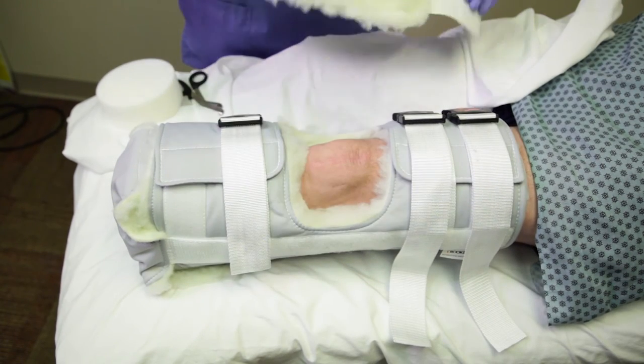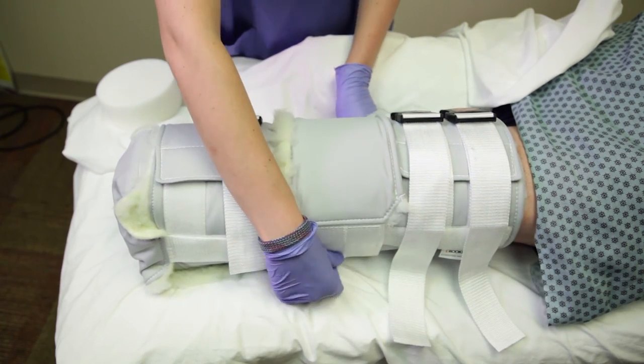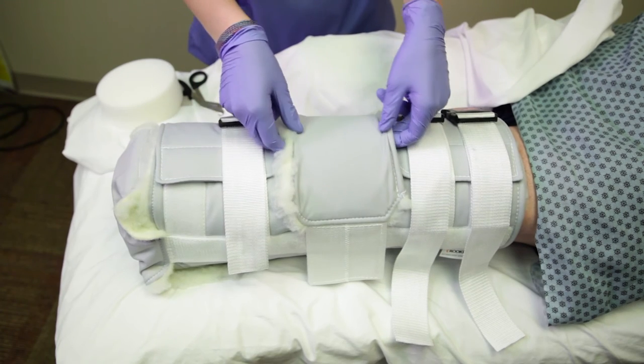Simply undo the hook and loop straps and remove the patella pad completely from the dressing. Reattach by gently placing the patella pad over the patella with both hands.